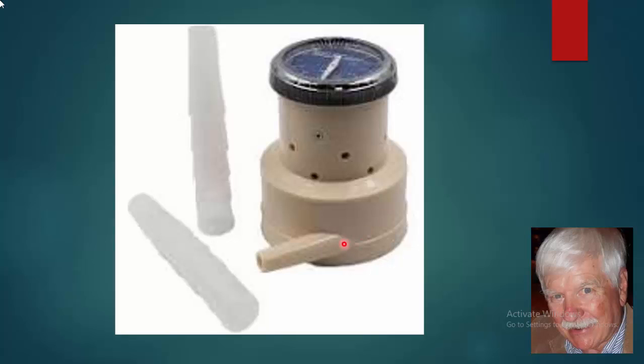This is what we use mostly now. This is a little handheld spirometer. You set this needle to 0, then you put a mouthpiece on it. You breathe in as hard as you can, and then take it all in, and then you let it all out, and that will also tell you your vital capacity.